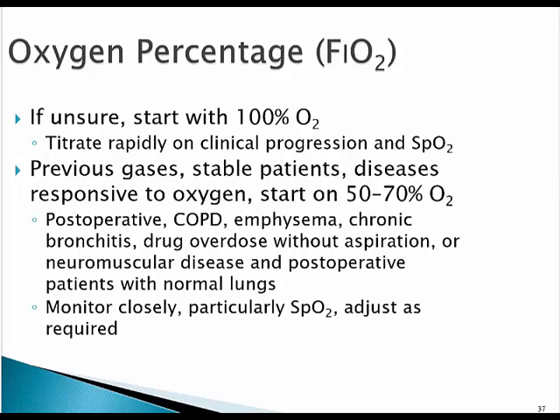The FiO2, or the oxygen percentage. If you're unsure about what's going on with the patient, you're going to start them at a high FiO2 at 100% and then titrate it rapidly down on clinical progression and saturation. This is many times what we do with our surgical patients for pretty much anyone. Start them off real high and then titrate it rapidly.